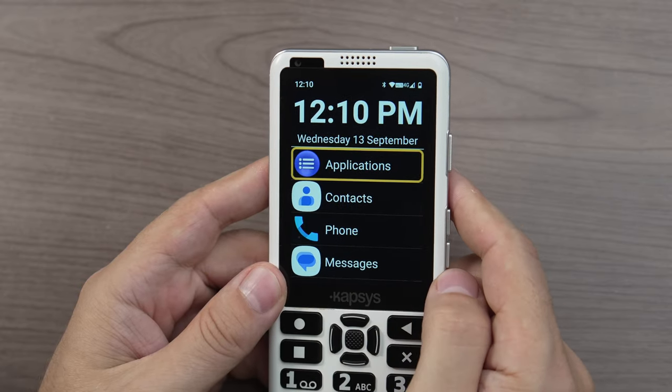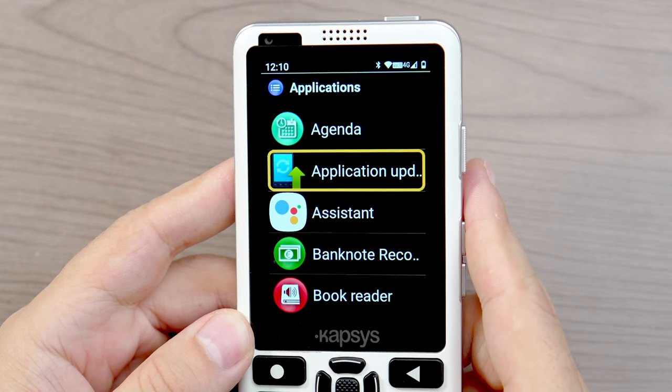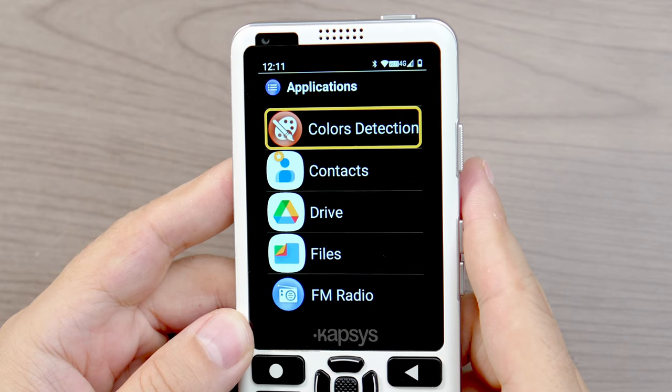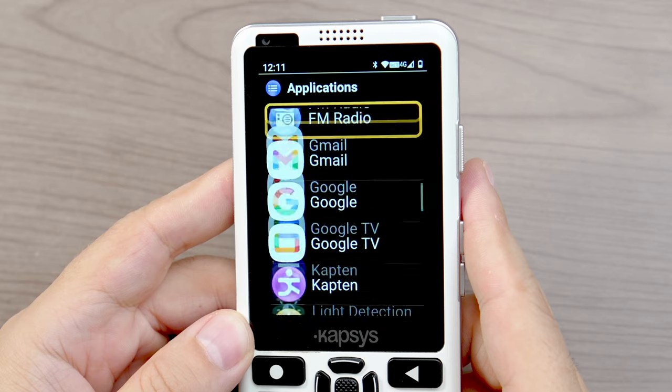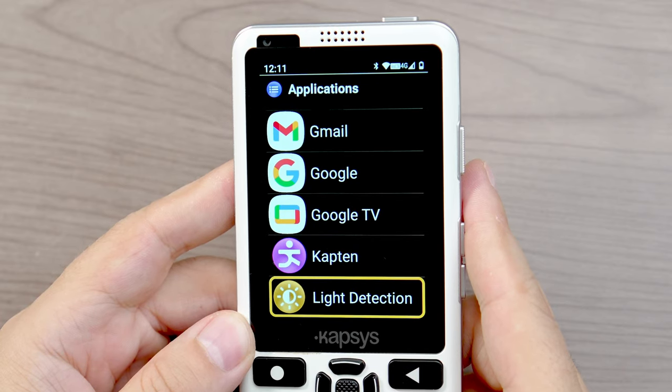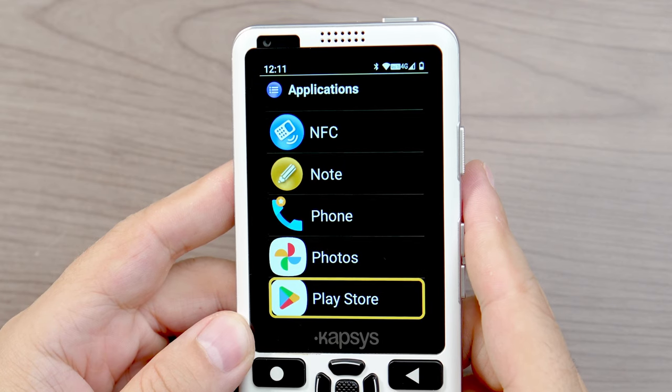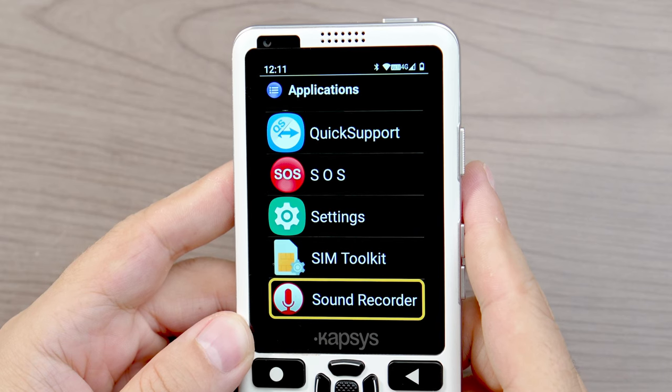In the applications list we have a vertical scrolling list with a ton of really useful apps — many familiar ones like Camera, Photos, the Play Store, and Google Chrome. There are also vision-specific apps like Google Lookout, a color identifier, and a magnifier, so it's great to have those pre-installed. For entertainment there's FM radio, internet radio, YouTube, YouTube Music, and a book player. What separates the SmartVision from some other accessible phones is that it's a fully working Android phone, including the ability to download and install whatever apps you want from the Google Play Store.